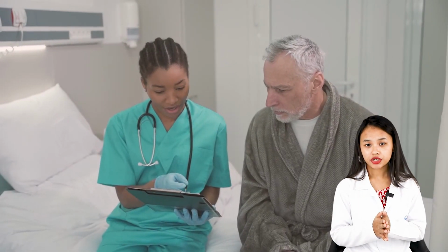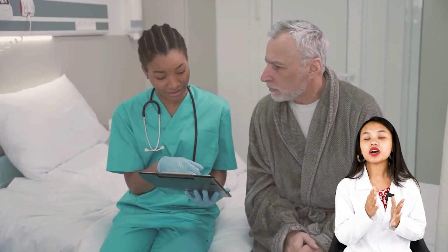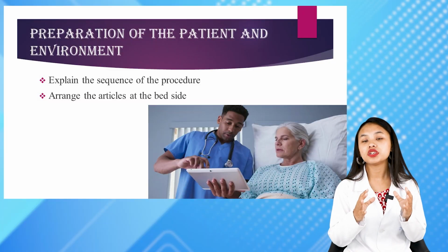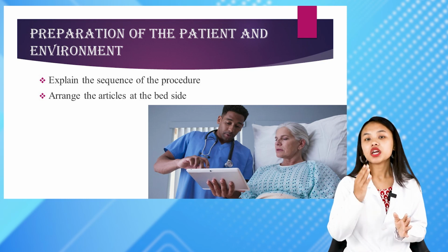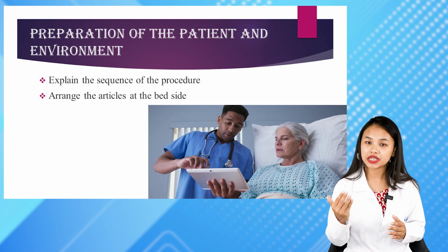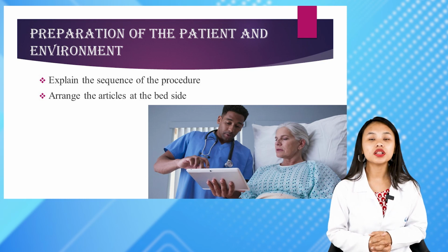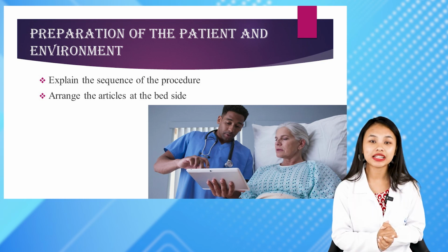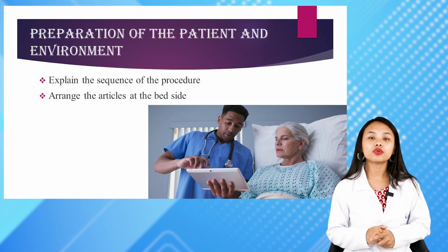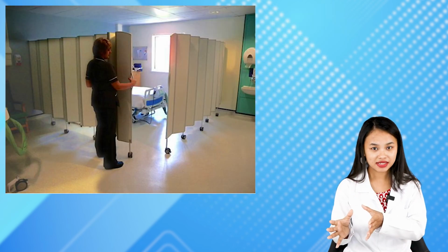During this preparation, the first thing you as a nurse must do is explain the sequence of the procedure to the patient, because if he or she gets knowledge of what is to be done and what its purpose is, then it will enhance their cooperation level. As a nurse, you also need to make sure that you arrange all the articles required at the patient's bedside.